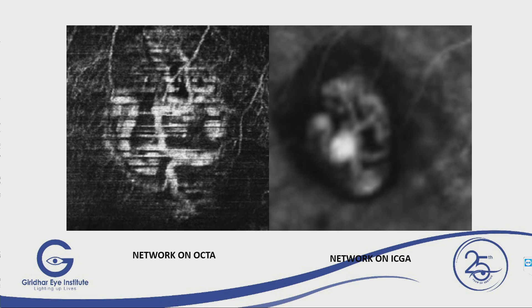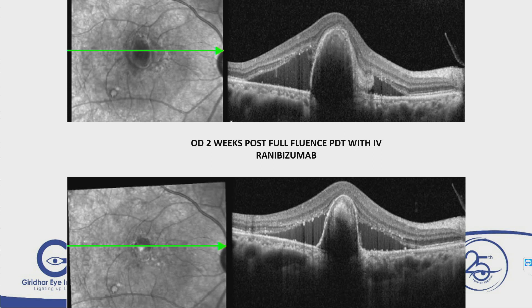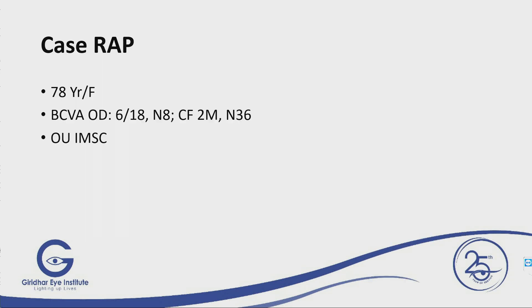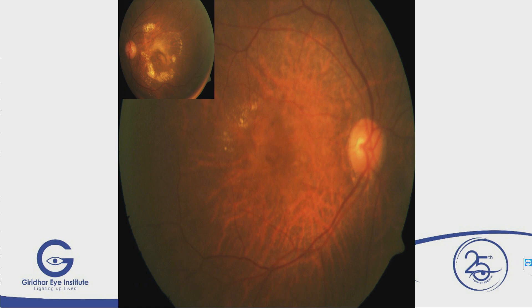OCTA shows almost similar findings to ICG, so OCTA is sometimes as good as ICG in identifying polyps. Following full-fluence PDT with injection, the patient gradually settled and is doing well. Post-PDT, the polyp has regressed — the left image is pre-treatment and the right is post-treatment. Both OCT and OCTA are very useful in follow-up.